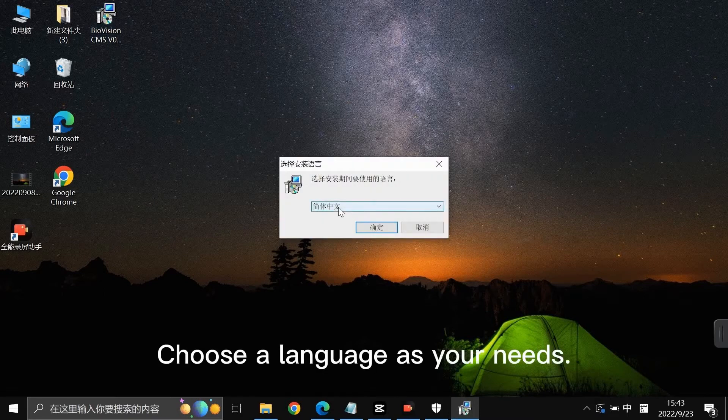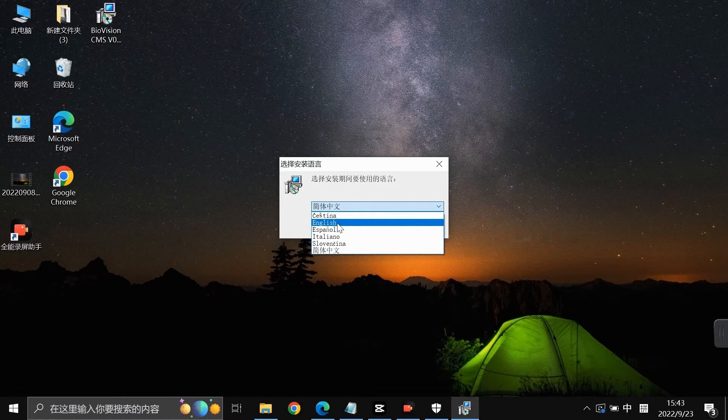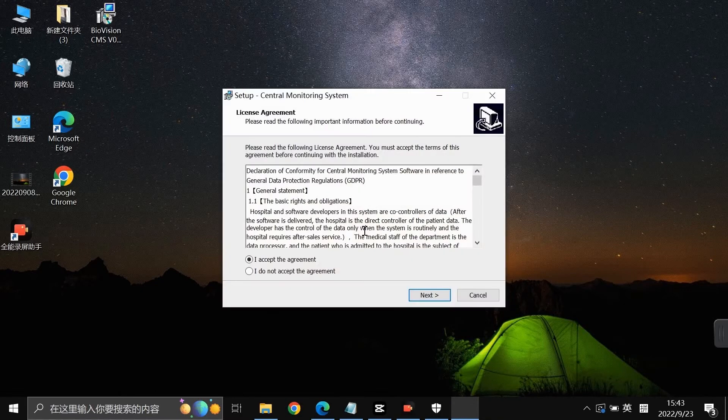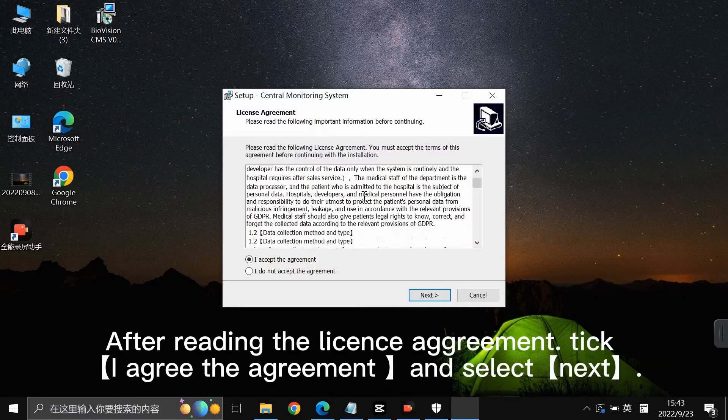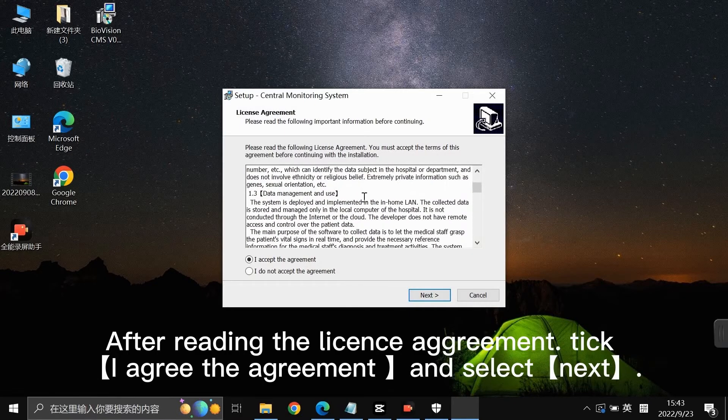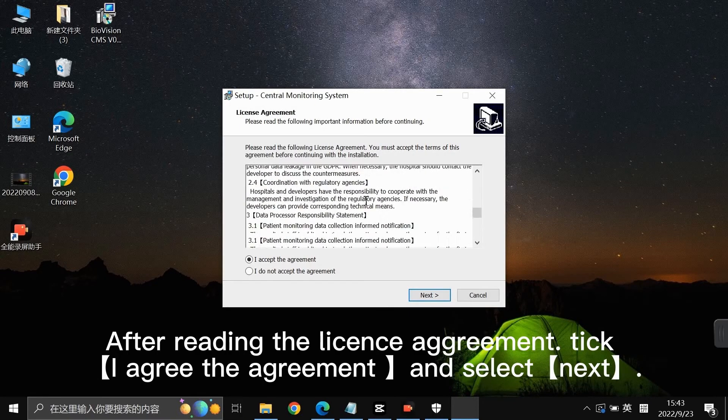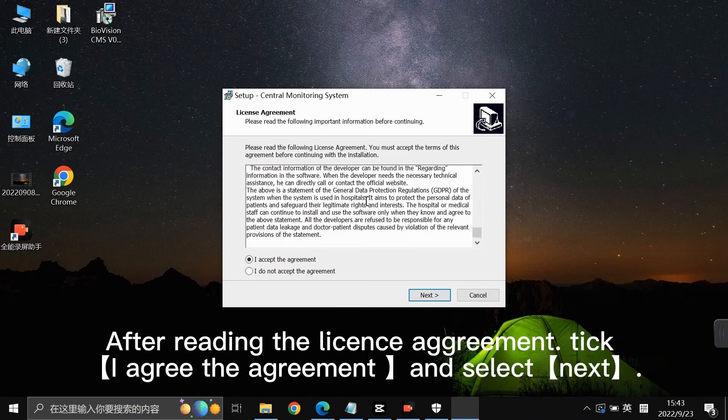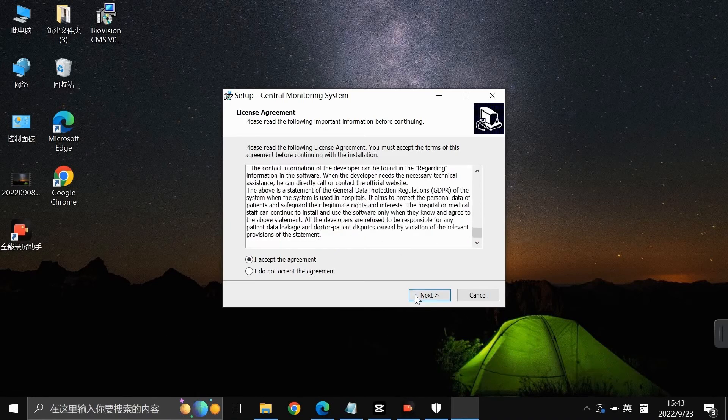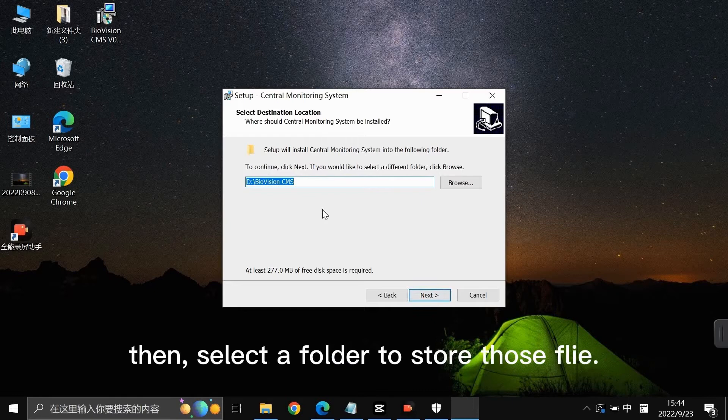Choose a language as your needs. After reading the license agreement, tick I agree the agreement and select next. Then select a folder to store those files. Click next button and install button.